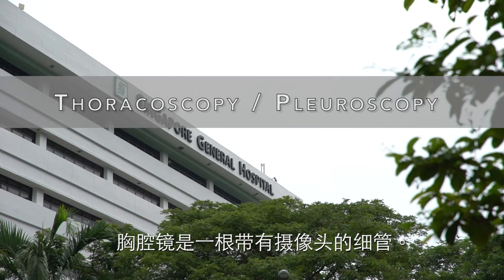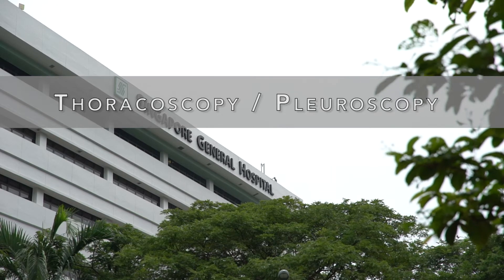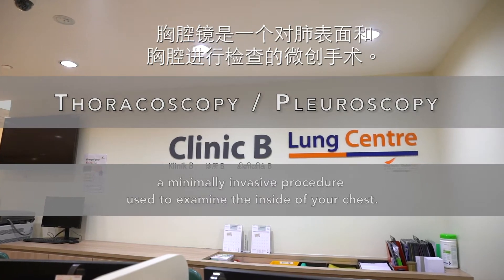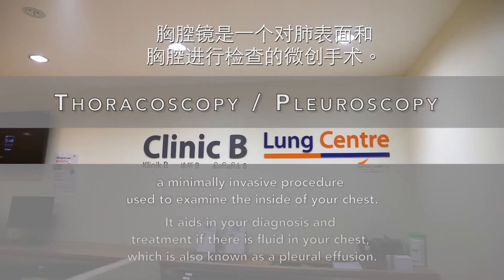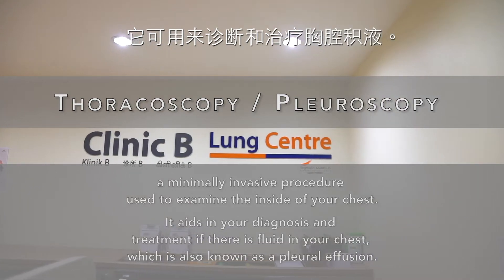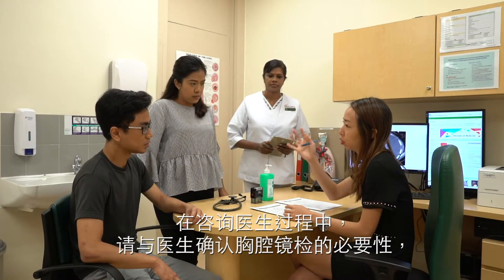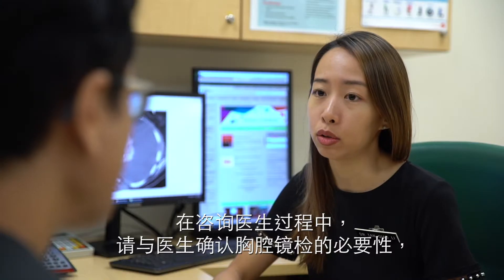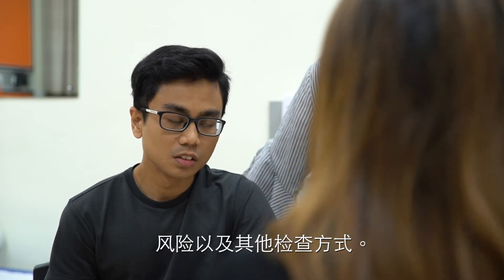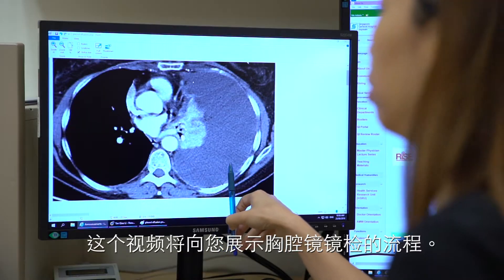A thoracoscope is a thin flexible tube with a camera attached at the end. Thoracoscopy is a minimally invasive procedure used to examine the inside of your chest. It aids in your diagnosis and treatment if there is fluid in your chest, which is also known as pleural effusion. During your consultation, please be sure to clarify with your doctor on the need for thoracoscopy, the risks involved, and the alternatives available to you.